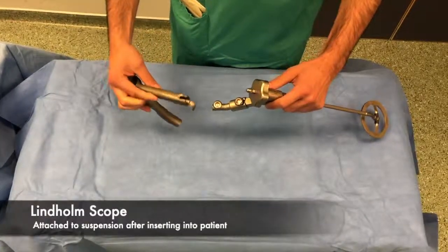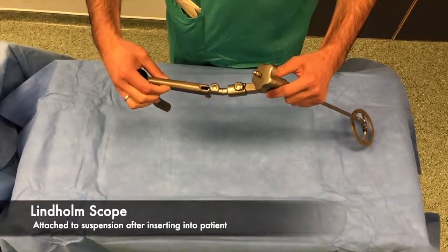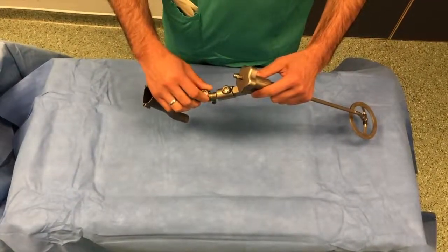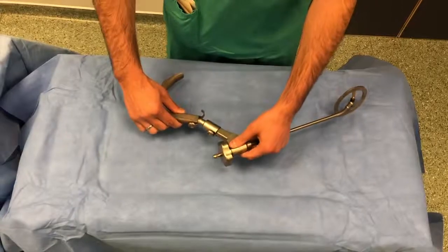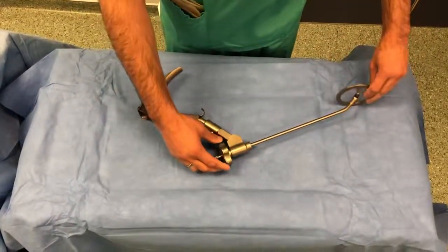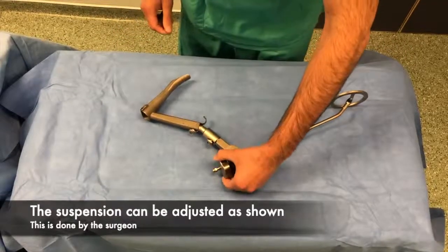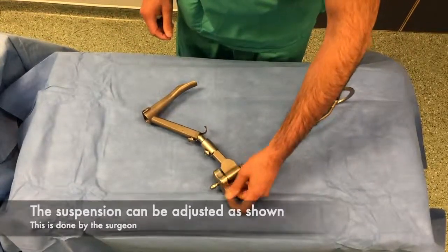This is the Lindholm laryngoscope. It inserts into the end of the laryngoscope holder and is held in place by screwing in this bolt. The chest support can be adjusted, but this adjustment of the laryngoscope position should only ever be done by the surgeon.